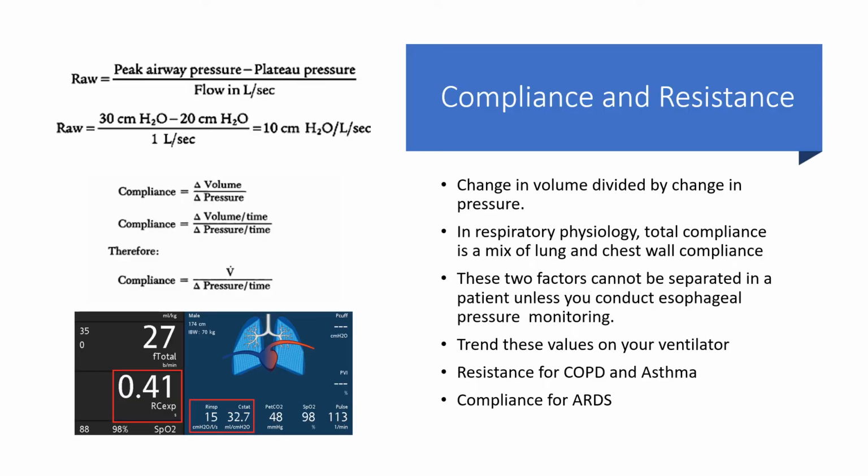Most ventilators have a way of measuring what is known as compliance and resistance. And you say, why is that important? I found it very important when I used to do my education with my staff that I wanted them to understand what resistance and compliance was.